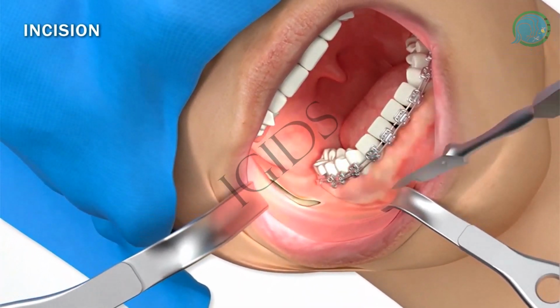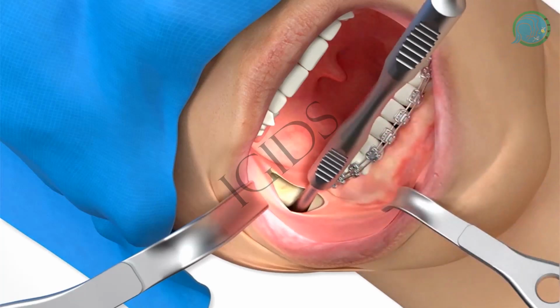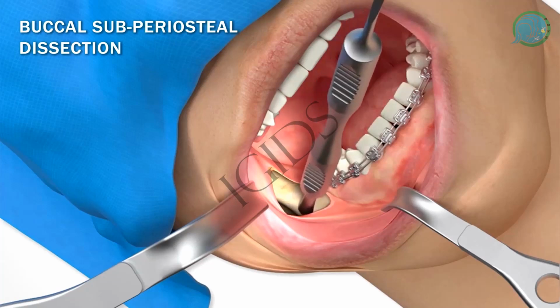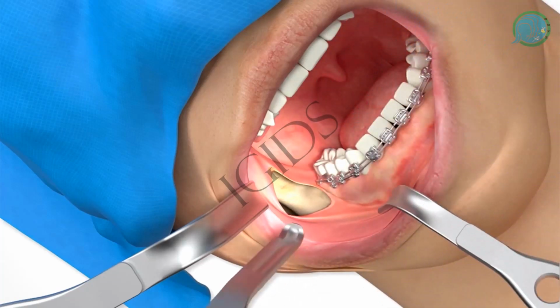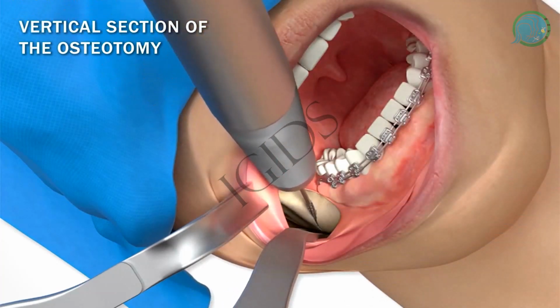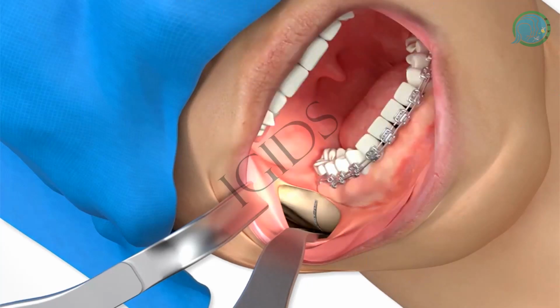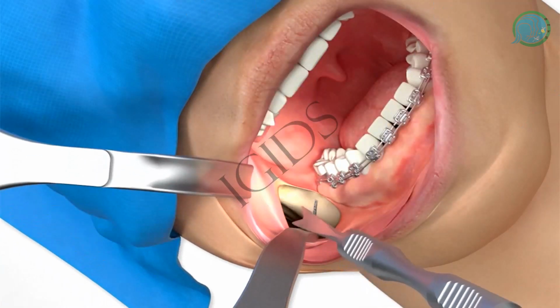Incision begins at the anterior aspect of the ramus and runs down through the lateral crest of the oblique ridge. The cut is completed through the periosteum to the bone. Periosteal reflection starts laterally over the body of the mandible, extending to the inferior border and continues over the anterior aspect of the ramus. Then the vertical cut is placed at the horizontal ramus between the first and the second molars and is extended downwards to the inferior border.